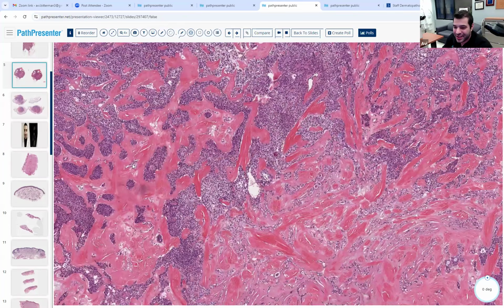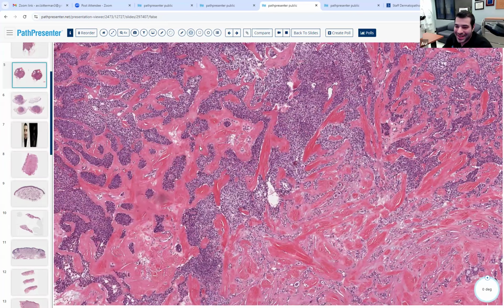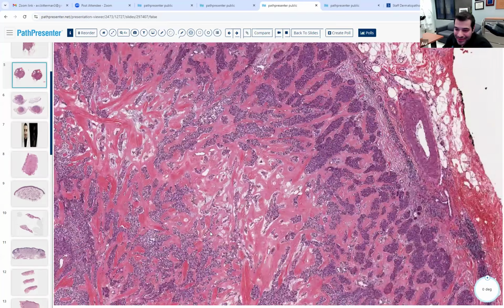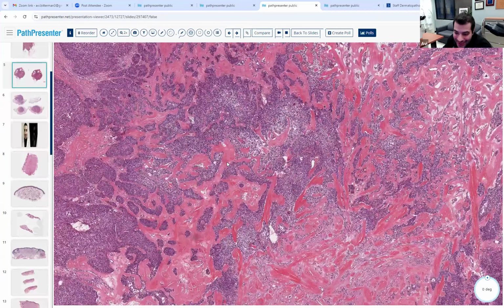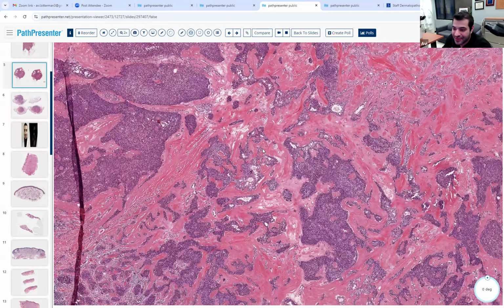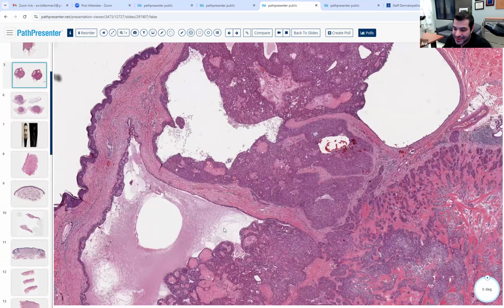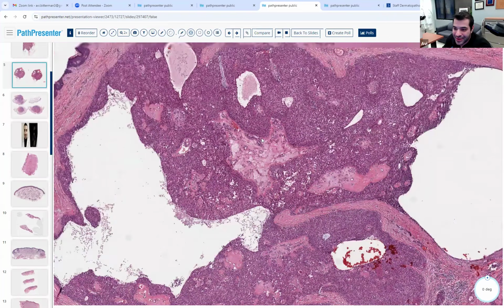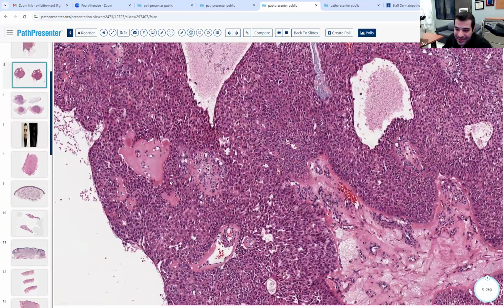See how this looks? It's very fibrotic, almost pinkish red. It's reminiscent of keloidal collagen, but not quite like that. Some people call that poroma stroma. I like to call that hidradenoma stroma because I see it more often in hidradenomas than poromas. But this stroma is really good for hidradenoma. And like you said, it's nodular and there are cystic components as well. You mentioned there's a lining. There are some areas, yeah, like this stroma here too.